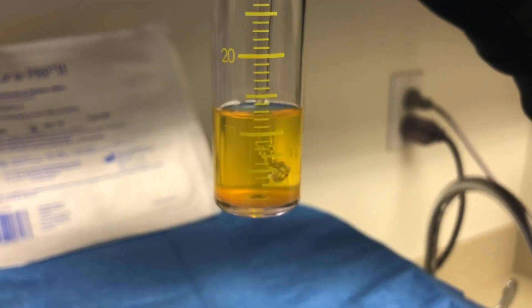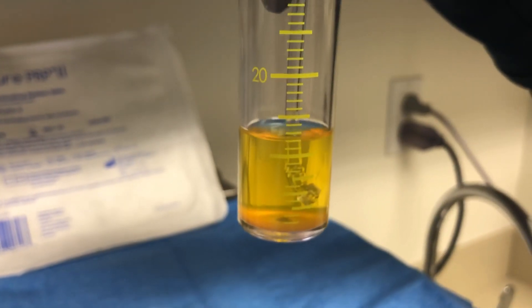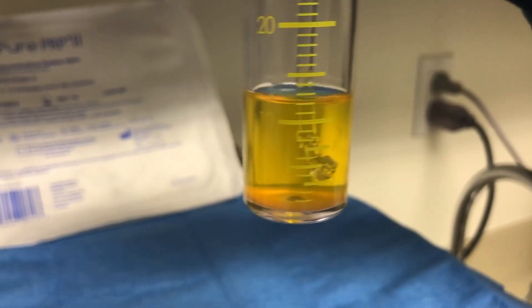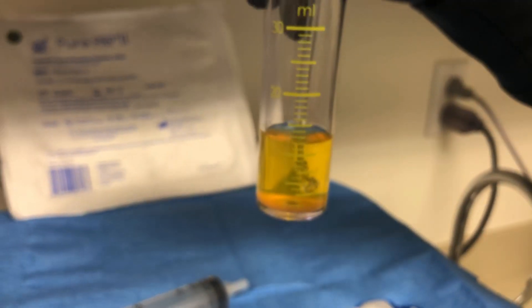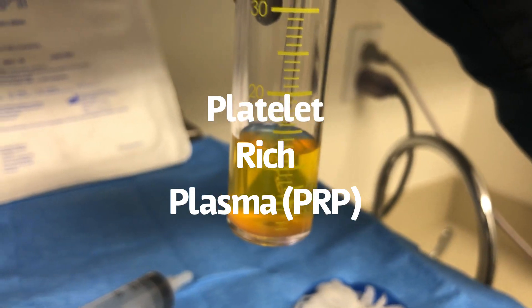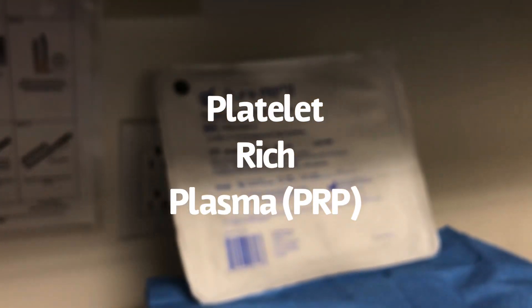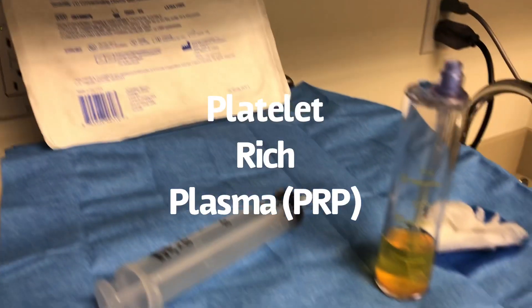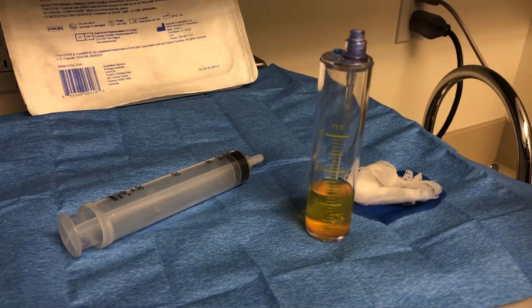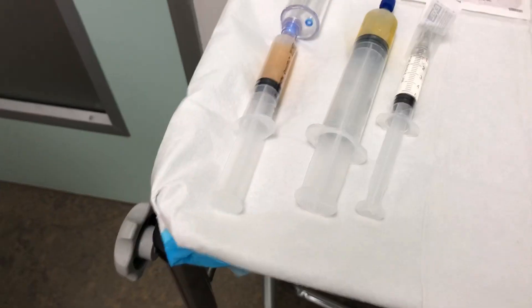We're going to remove everything except three cc's, then swirl gently to lift the platelets off the bottom of the container, resuspend them, and put them in a sterile syringe ready for injection. Platelet-rich plasma using the Pure PRP M-Site system — this is for me, Dr. Steve Mora, for the treatment of my post-traumatic arthritis.